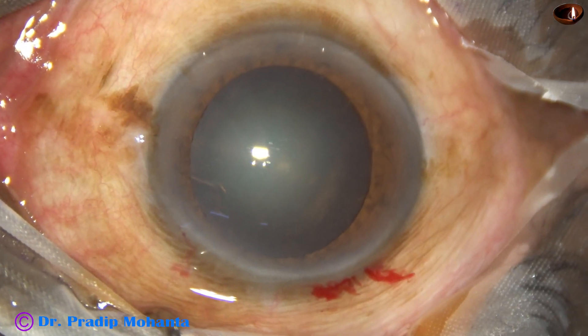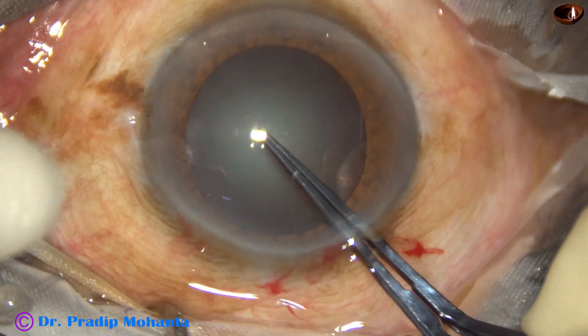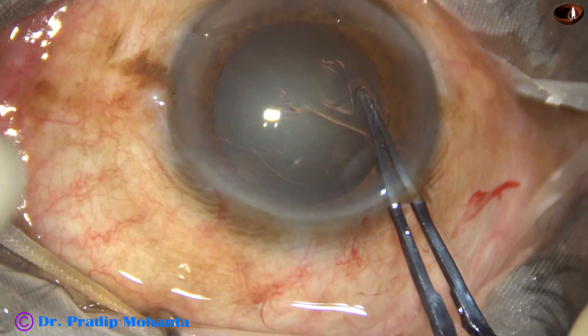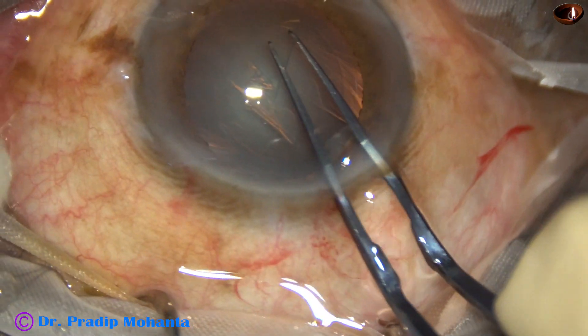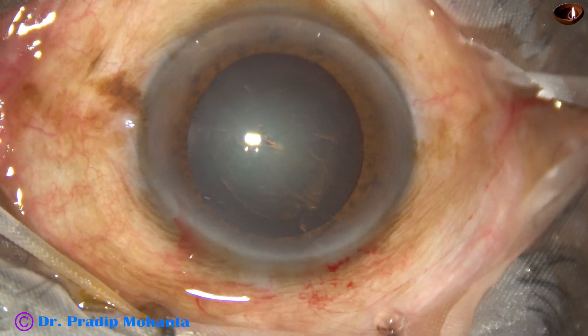Now capsulorhexis is done with the help of Utrata forceps. A capsular tag is raised by the tip of the Utrata. This capsular tag is guided anticlockwise all around to get an adequate sized rhexis.